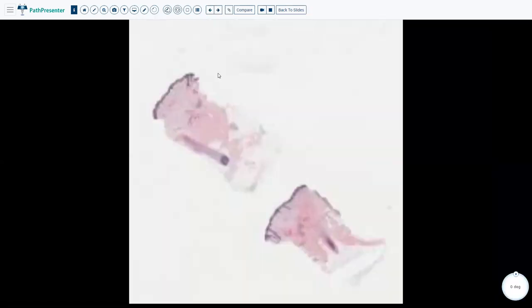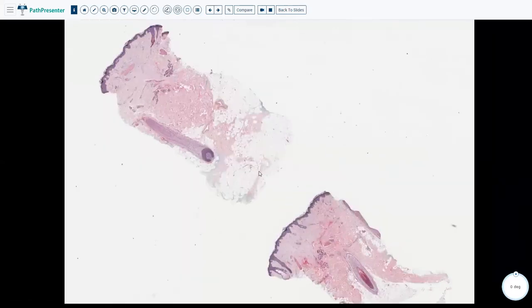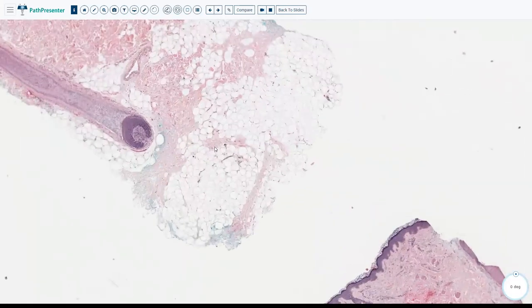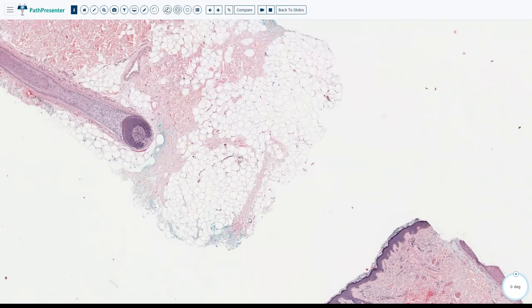When we look at the fat in normal skin, we can see it is divided into fat lobules and between the fat lobules you have a very thin layer of septa that is dividing the fat lobules.